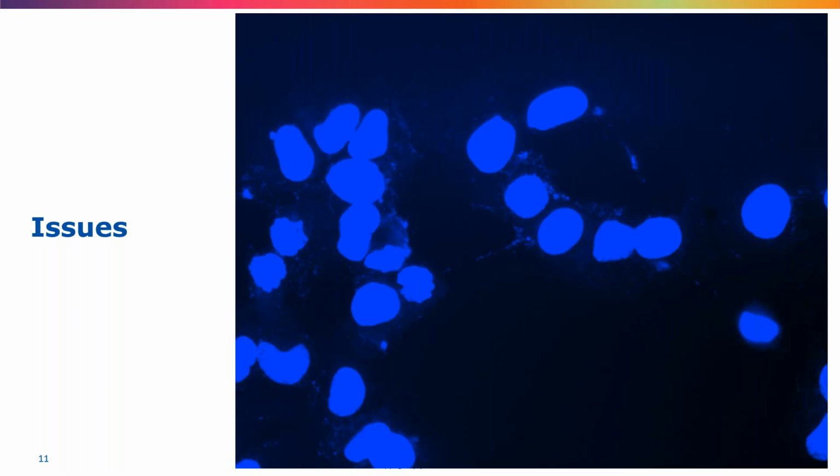It also stands that the most common causes of cell culture contamination boil down to about 6 species of Mycoplasma. So there are just 6 different types that are responsible for 95% of all cell culture contamination. And again, that's a global figure.